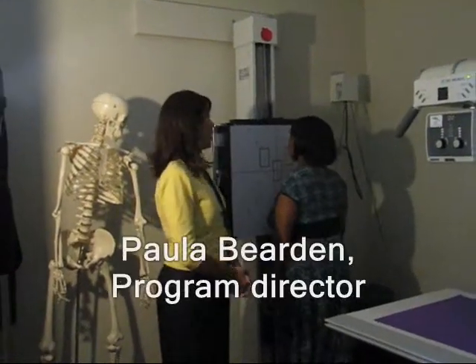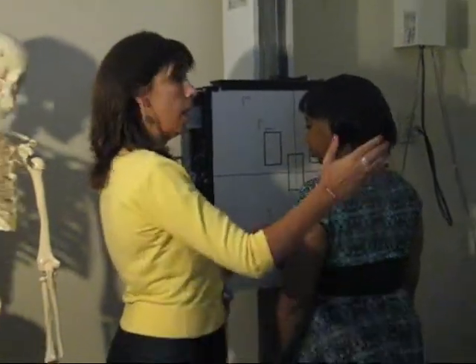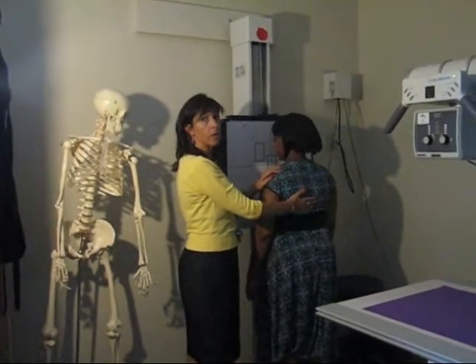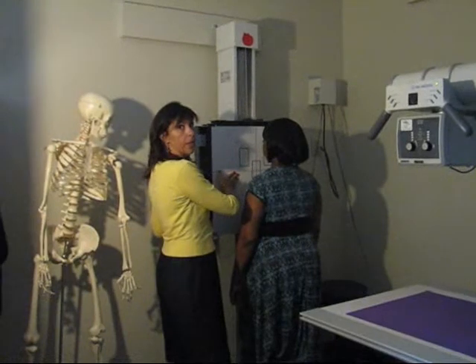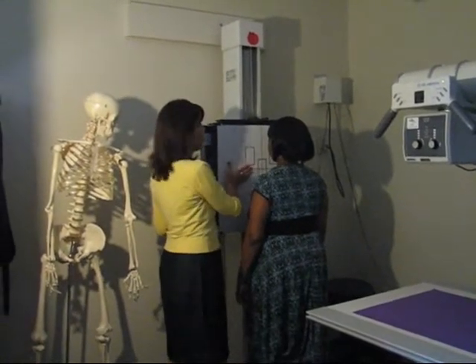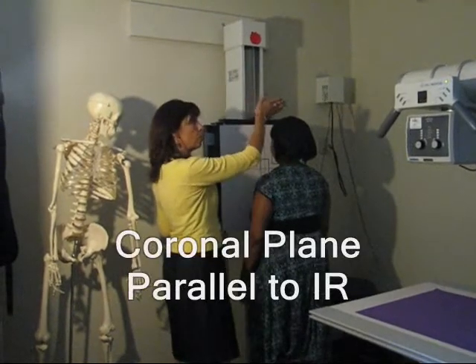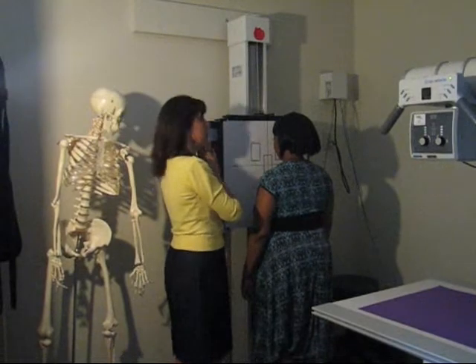We're doing a chest x-ray, and we're going to start with the PA projection. The PA projection means that the central ray is going to enter the posterior part of the patient, and the anterior part of the patient is going to be turned towards the image receptor, which means that the coronal plane of the body is parallel with the image receptor.